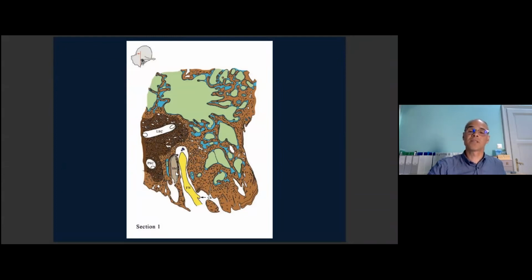The stapedial muscle you can always find medial to that, and sometimes you find an air-filled area medial to the stapedial muscle. This is a deep tympanic sinus. Unfortunately, cholesteatoma can grow into this area, and to open this area posteriorly is almost never possible. So we have to come from anteriorly through the ear canal, or we have to make a canal wall down technique to make the cholesteatoma removal easier.